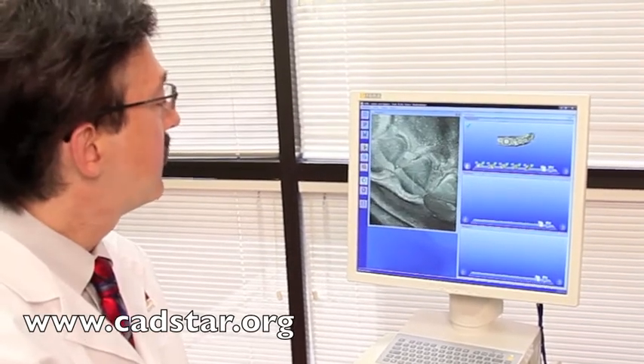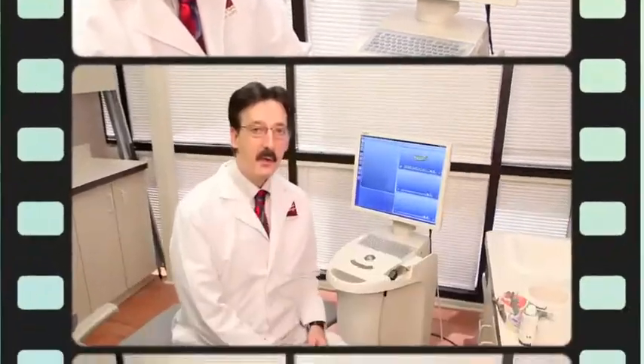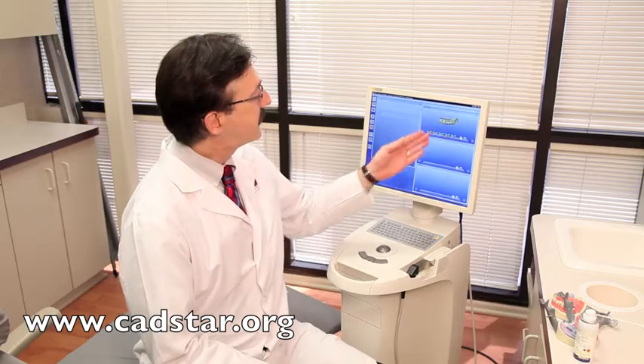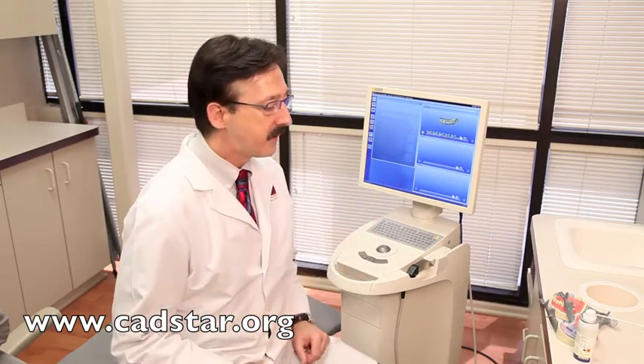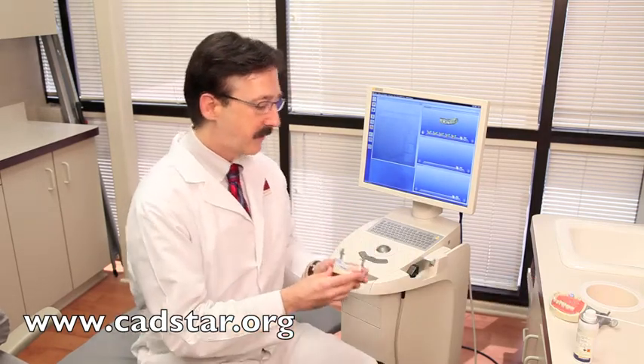Notice it doesn't take the picture unless it's stabilized — so if you had a little coffee in the morning, you may have an issue. We have successfully captured our preparation virtual die, with multiple images that the computer stitched together. Now we need a bite registration, and we'll use the nice occlusal control feature in the CEREC design.